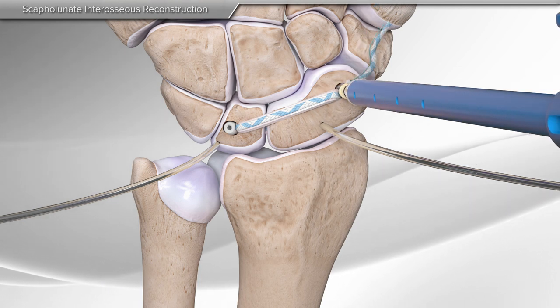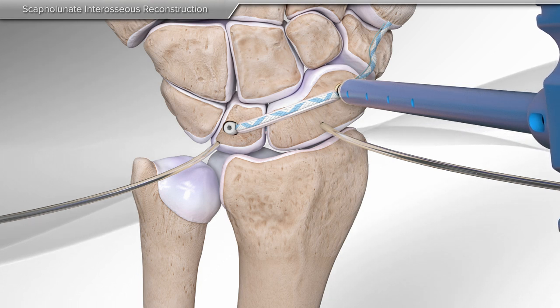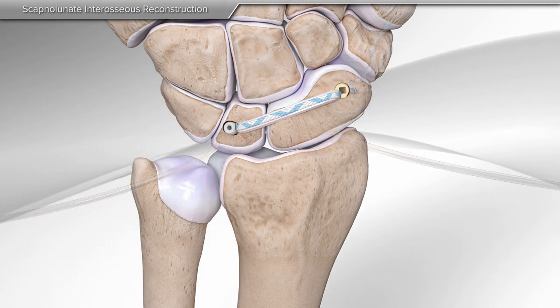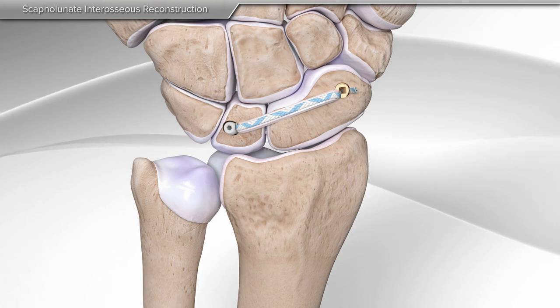A second anchor is then used to insert the same construct into the final bone socket. The remaining tape is cut, completing the scapholunate ligament reconstruction with internal brace ligament augmentation.